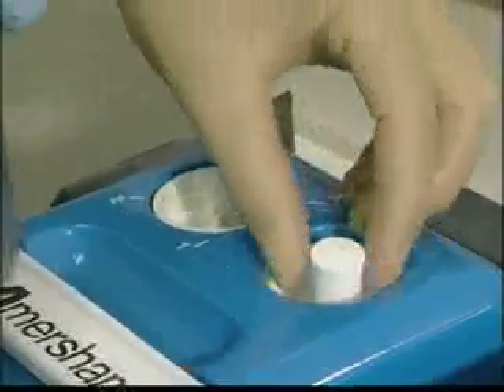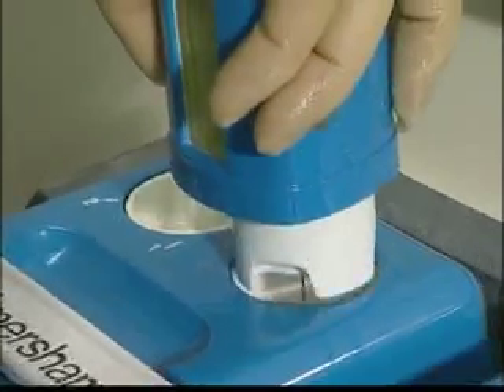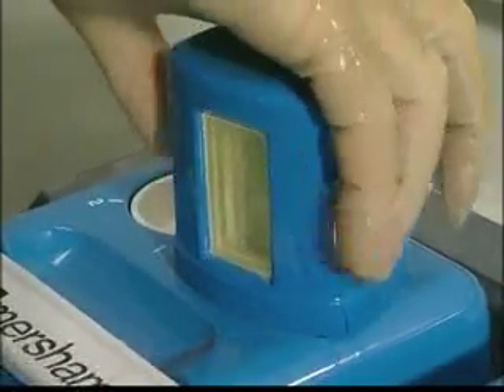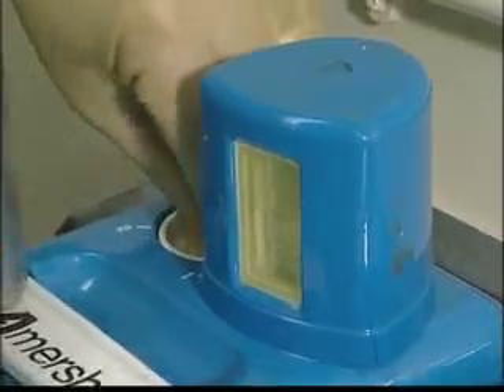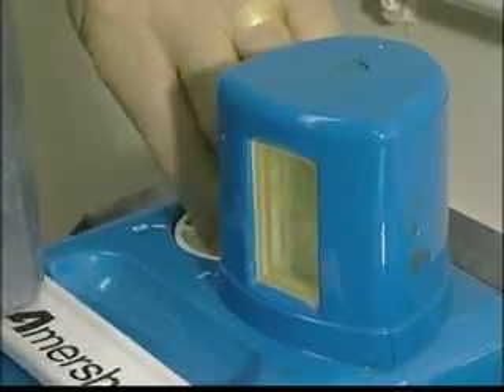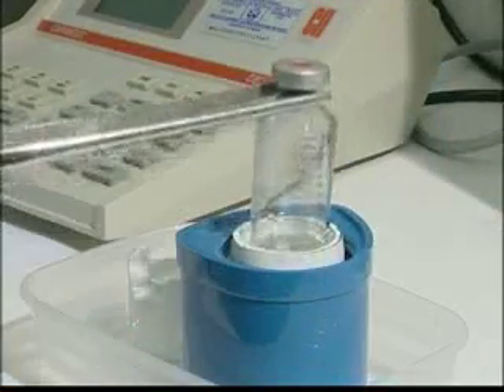The radionuclide used for most imaging techniques is Technetium-99m. This is extracted from a generator on a daily basis by passing saline solution through the generator, a process known as elution. Inside the generator, an ion exchange process results in the production of a solution of sodium pertechnetate.